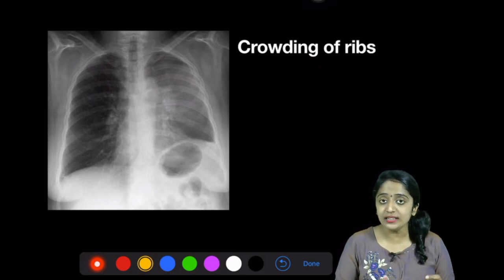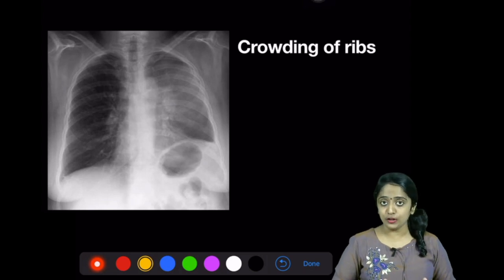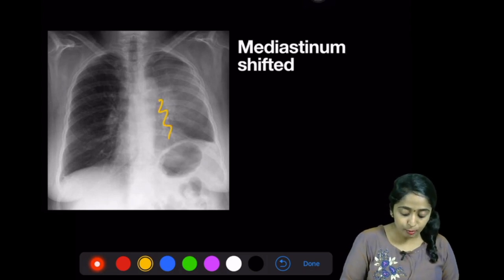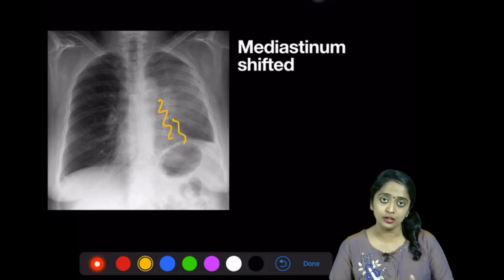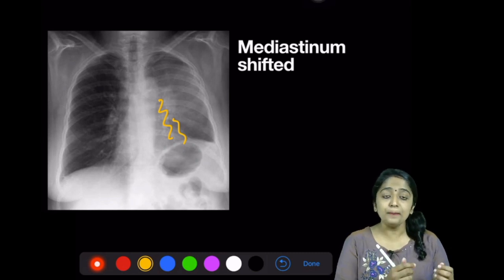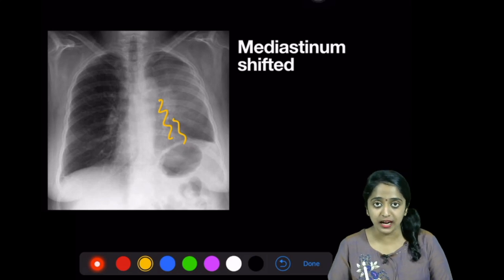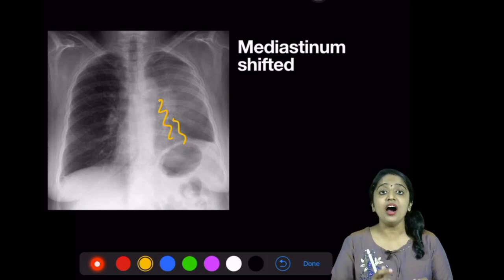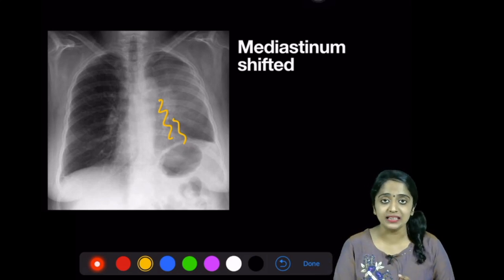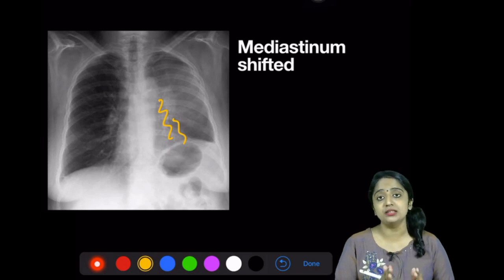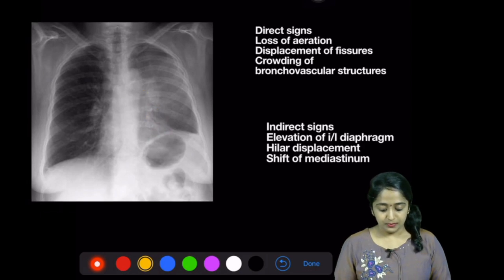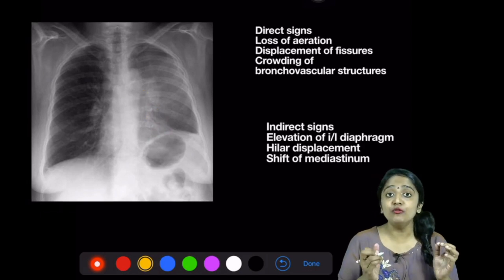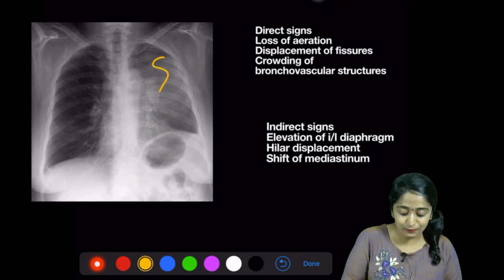Further, looking at the mediastinum — what can you make out? The mediastinum is shifted. Look at the left side of the heart — you cannot really appreciate the left side of the heart; it seems as if it has been cut off. This is because the mediastinum is shifted to the left side. The heart has got rotated posteromedially — that's why you get this particular appearance.